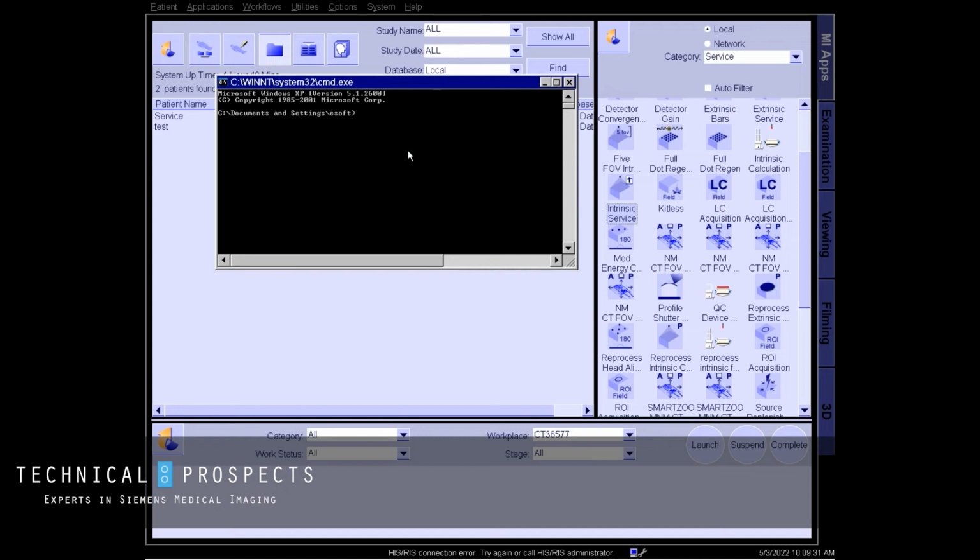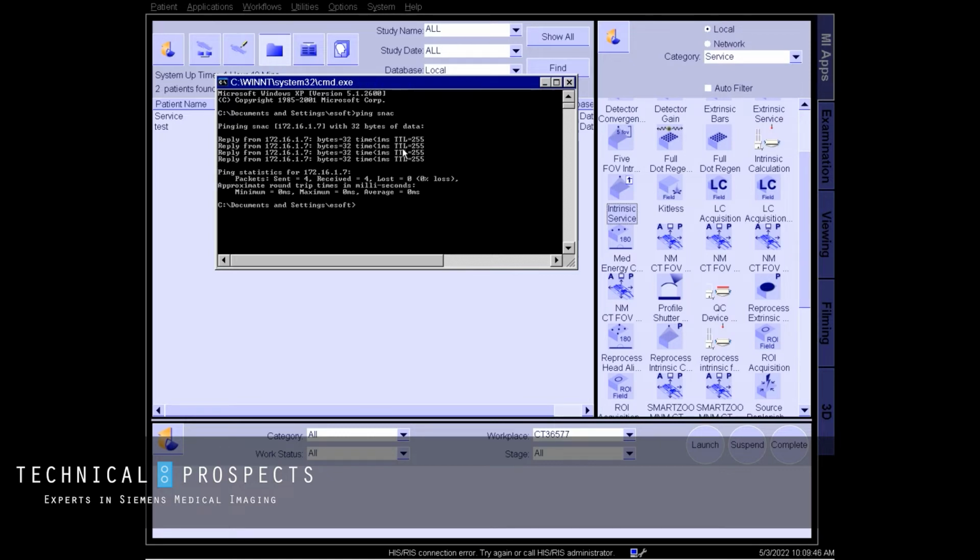At this point, if we're having communications problems or suspect communications problems from the system to the SNAC, we can simply type in ping SNAC. That will test the USB connection from the gantry to the SNAC. As you can see here, we're getting a reply of 172.16.1.7. That means we're talking.